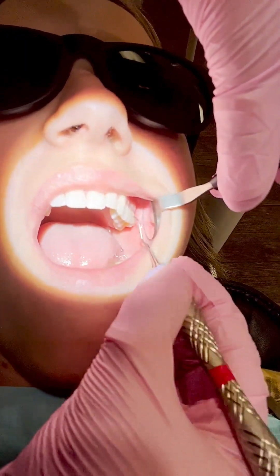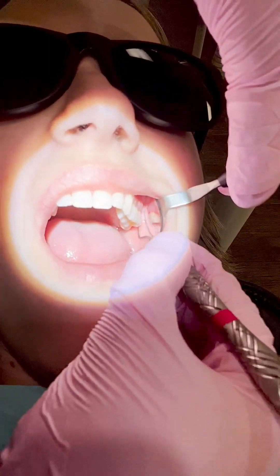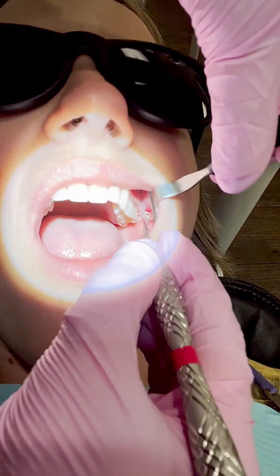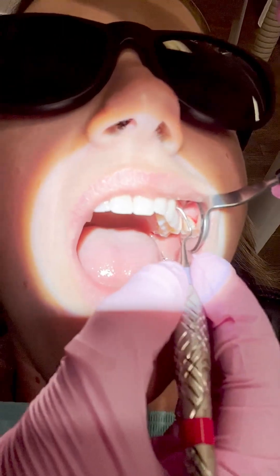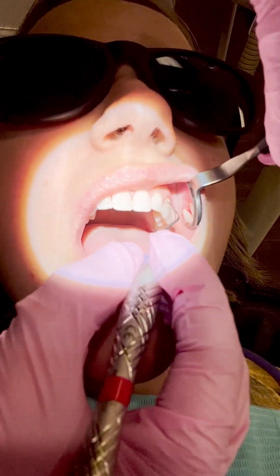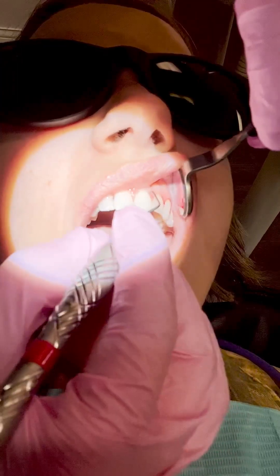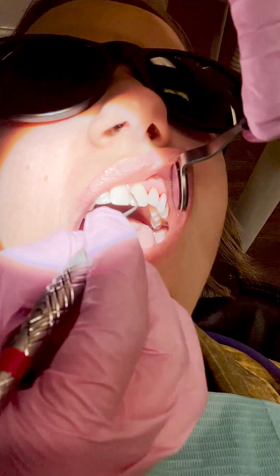I go over my strokes a lot — I'm always going over my strokes and going into the contacts. Oblique strokes, facial, going around. I usually start at the distal and work my way up to the midline. I do a lot of exploratory strokes where I kind of lightly feel, and when I feel a click or anything, I go over it really good. I always scale after I cavitron — I've already cavitroned her whole mouth. Cavitroning removes about 90% of all the buildup. Scaling is mostly just to get interproximal better.